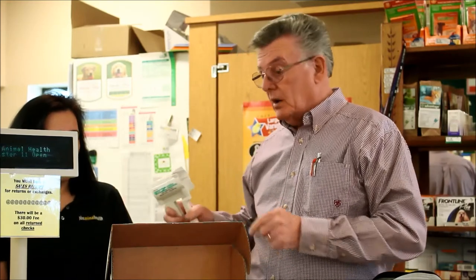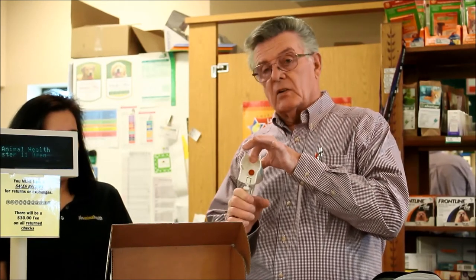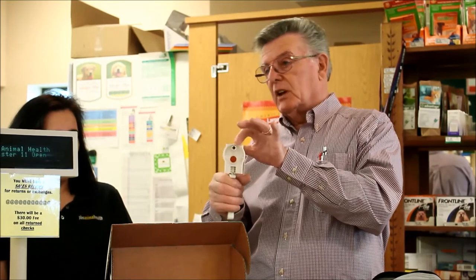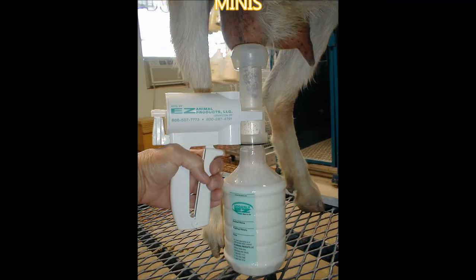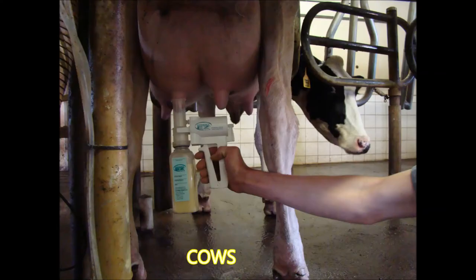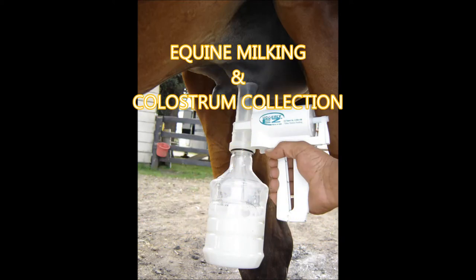Just test the vacuum on these pumps to make sure that little red valve is working properly. Simply put your finger or thumb over that hole — this should not have to pump. If it pumps easily, then you need to replace the valve.